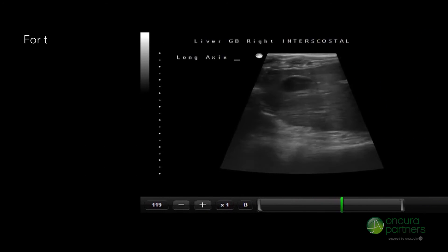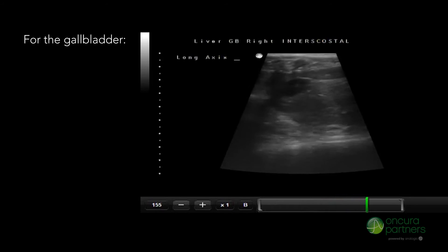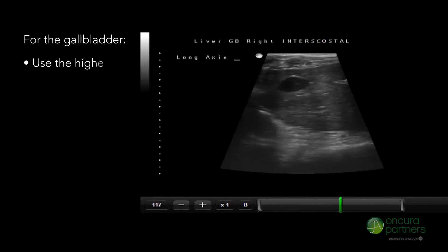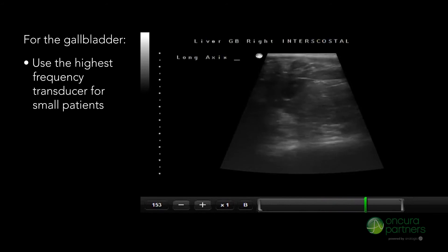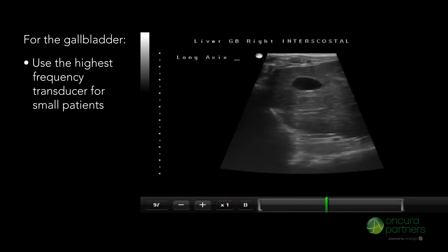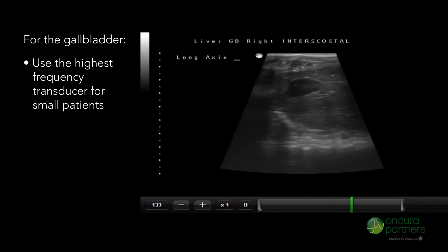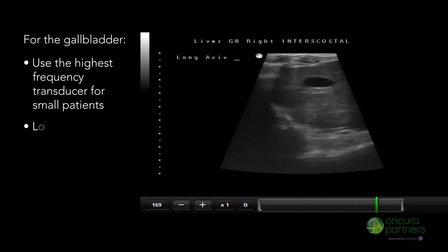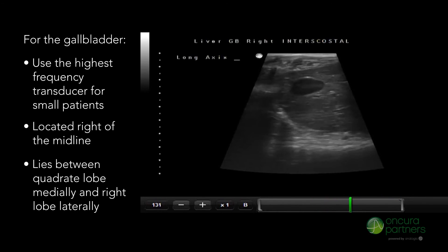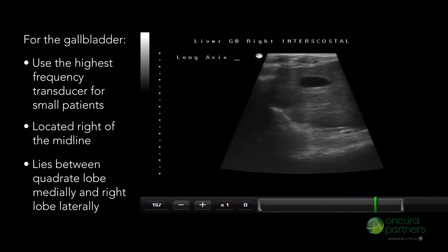When evaluating the gallbladder, place the patient in left lateral recumbency so that their right side is facing upwards. Use the highest frequency transducer for small patients, as this is a small and superficial organ. The gallbladder is a pear-shaped vesicle located right of the midline, lying between the liver's quadrate lobe medially and right of the medial lobe laterally.